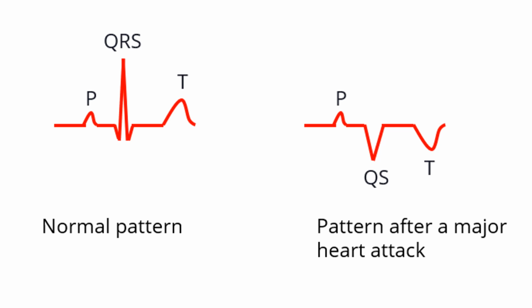Other than heart attack, ECG is useful in getting knowledge about the nature of various parts of the heart and its function. If certain chambers of the heart are enlarged, it is manifested with a specific pattern in the ECG. Disorders of cardiac rhythm have their own electrocardiographic patterns depending on the site of the abnormality.